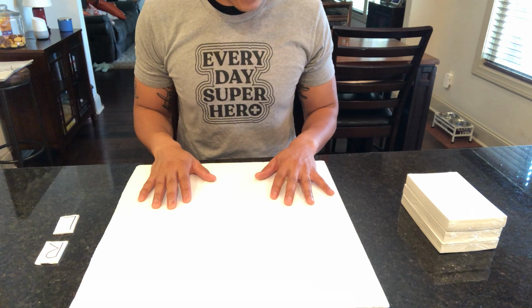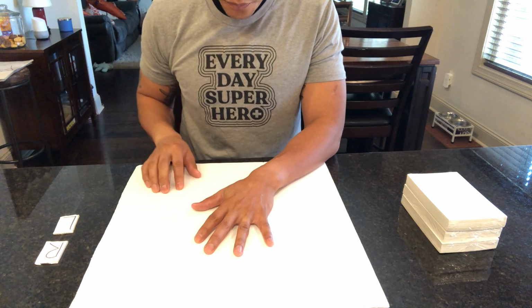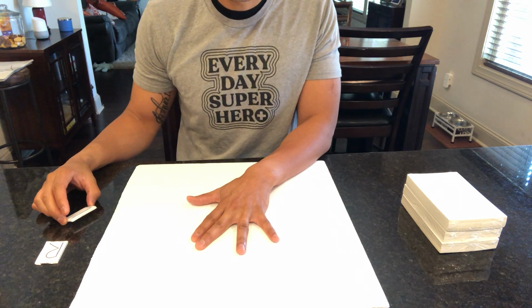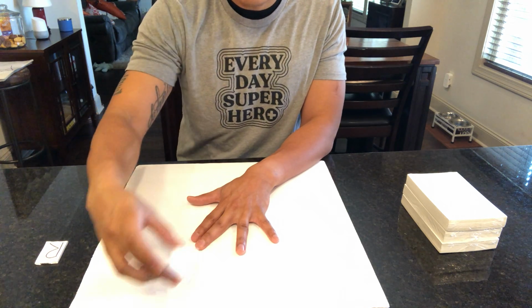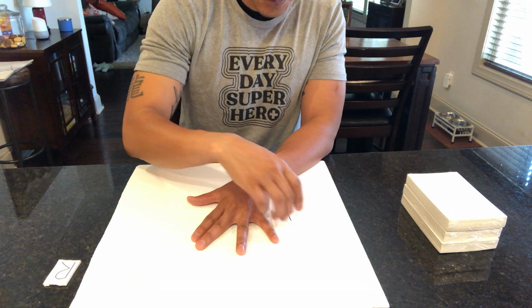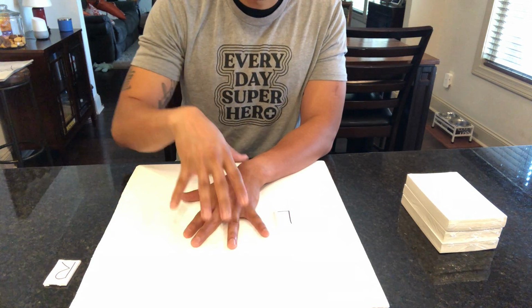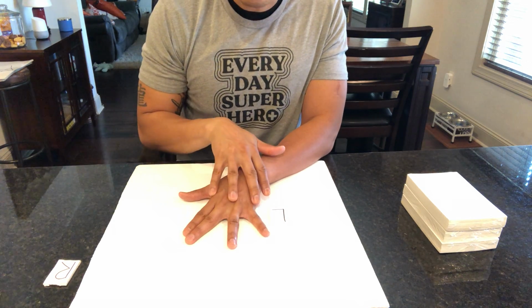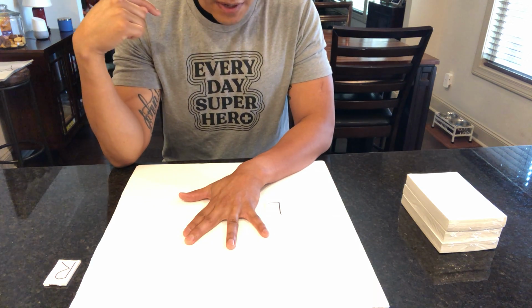So we'll start by saying that on my left hand, the 4th digit is the affected finger. So we'll start out with a PA projection of the left hand 4th digit. So I have markers here, the left and right. These are my play markers. So we'll put this one on the left side. And we'll say that the light of the X-ray is in this area here. We're going to spread out the fingers for a PA projection. Again, placing my marker here. 4th digit is the affected finger.